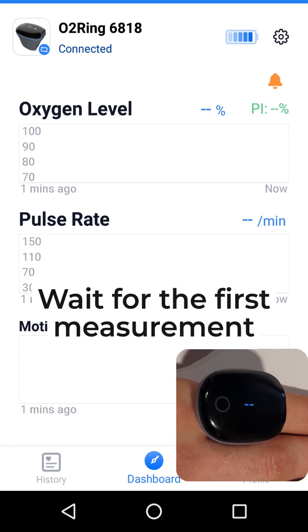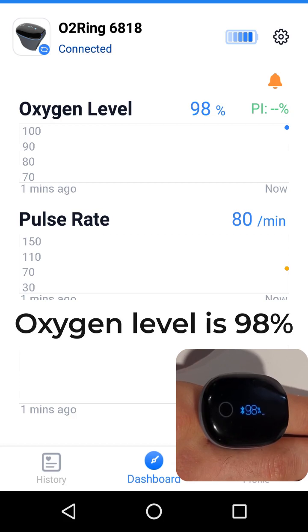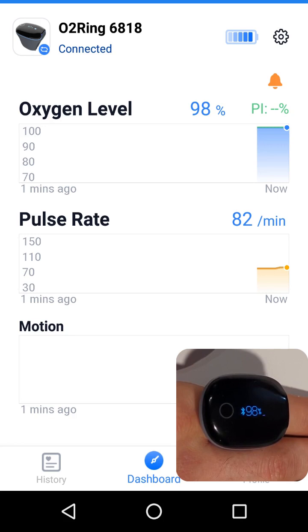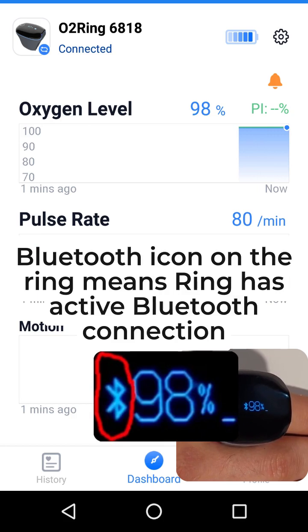Wait for the first measurement. Oxygen level is 98. The Bluetooth icon on the ring means the ring has an active Bluetooth connection.